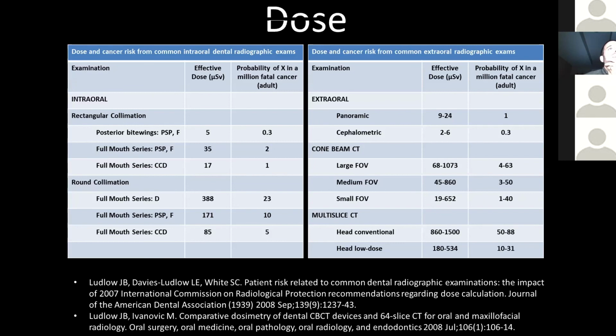You're welcome for the pie chart. All right. Oh, great. We have a mammogram dose is approximately 0.4 millisieverts. All right. And again, the units we were looking at were microsieverts. So those who are interested in that can do the math.